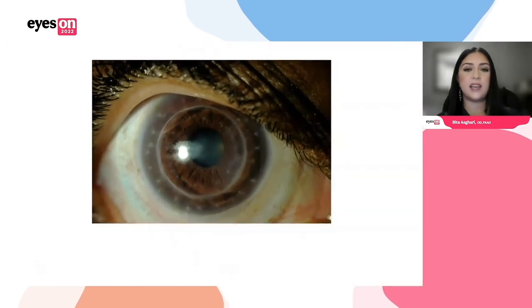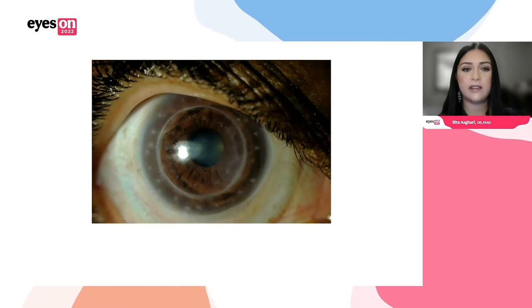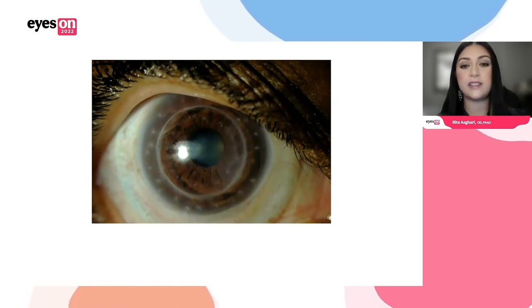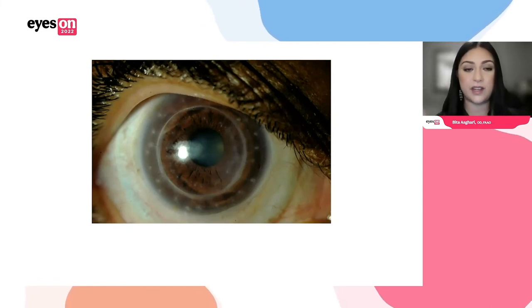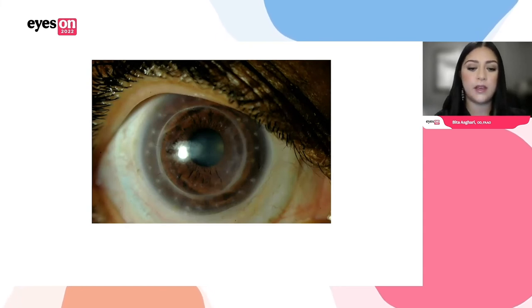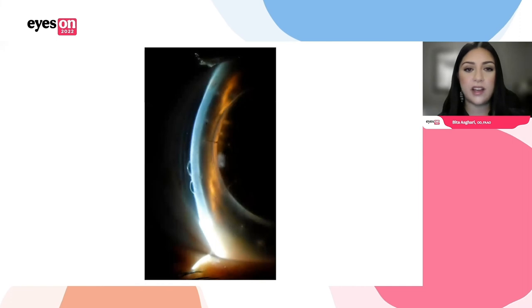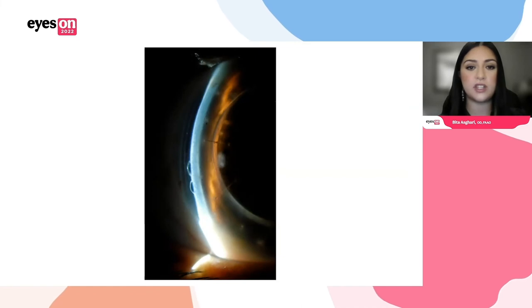Looking at the lens, there was really no significant impingement and no compression — the eye looked quiet and happy. But taking a closer look, there were pockets of bullae in the host tissue and adjacent toward the graft itself some microcystic edema as well. Of course, even if these weren't there I would remove the lens to get a full view. When I removed the lens, you could see in the image on the far left — the nasal graft-host junction — there was edema there that spilled over to the graft as well. There was a diffuse fluorescein image and an eccentric gaze fluorescein image showing significant edema in the peripheral aspect of the cornea with some inferior involvement of the corneal transplant.